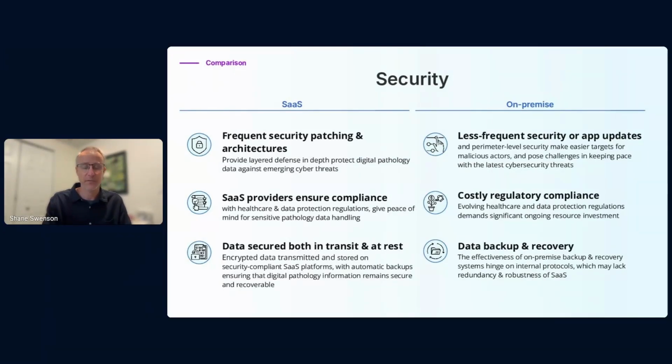They should be making very frequent updates to their software and to the software they depend on to make sure it's secure against the most recent emerging threats. In an on-premises system, update cycles are often more expensive. They might require downtime. They might require off hours, maintenance windows. And so there tends to be a hesitation to make those updates as frequently.